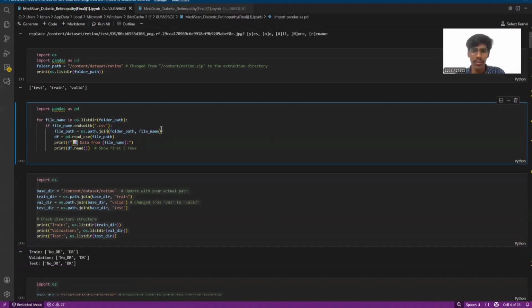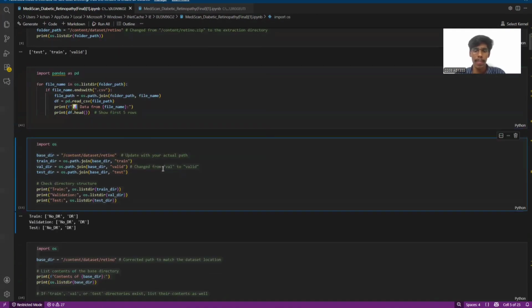In this cell, the code scans your folder to find every CSV file and opens them one by one. It then shows you a quick preview of the first 5 rows so you can see what is inside each file. In the fourth cell, it sets up the specific file paths for your training, validation, and testing folders. It then lists the contents of each one to verify that your dataset structure is correct and folders are accessible.